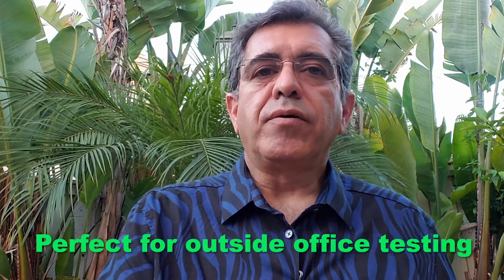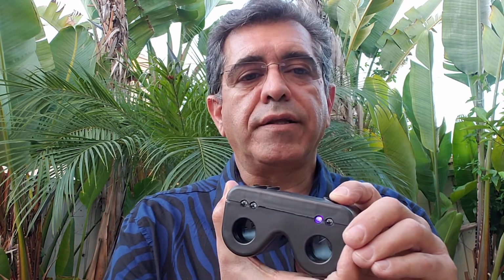This is useful for when you don't have access to a slit lamp and there is some complaint of a red eye or painful red eye. And this would be, for example, in nursing homes or hospitals, bedside testing. And since it's a portable device, you can take it with you to these settings. Or even in the office, if there's a room that doesn't have a slit lamp, you can easily check for these things. Just put a little bit of fluorescein and you can decide, because it's magnified and has the UV light, if it's a corneal foreign body, maybe a corneal ulcer, or just an abrasion.